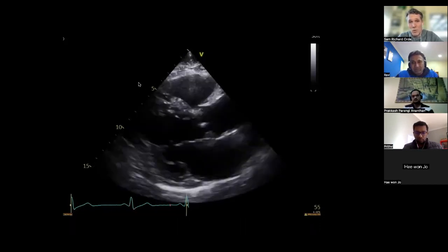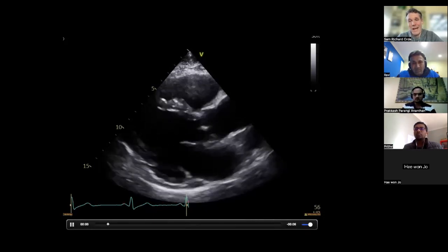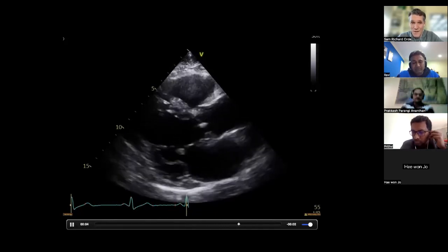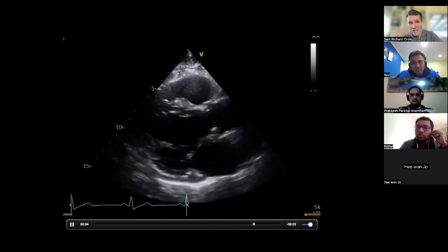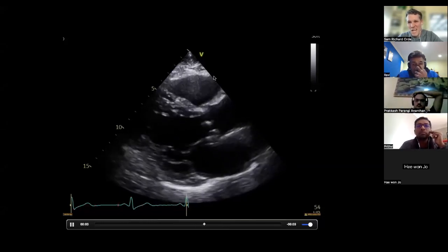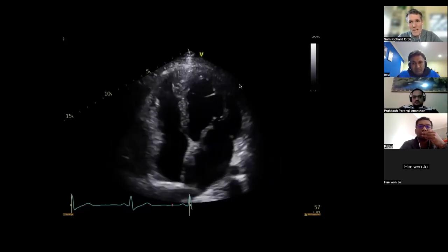Which brings me on to the reporting. If you think that these segments are hypokinetic, when I ask for regional wall, let's not forget to talk about the RV. The RV, of course, has coronary blood supply, and it's going to be affected, particularly if you've got inferior type changes. I think the RV is showing some maybe subtle signs here of not quite having that bellows function, and RV function potentially might be slightly down. But again, it is subtle and it's not pass or fail here.